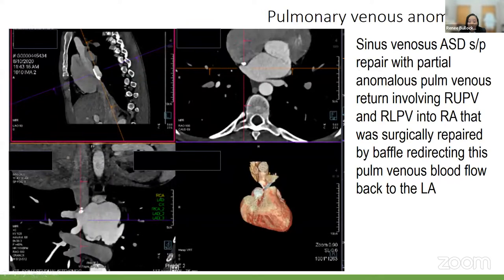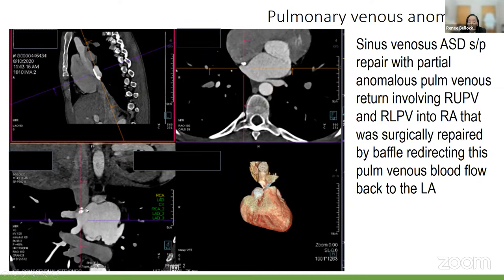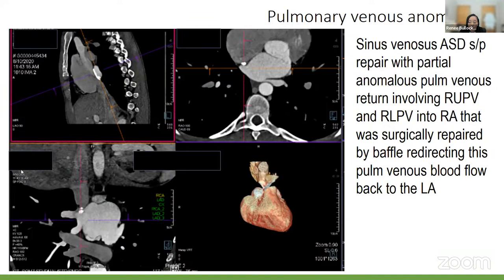This is an example of a patient who had a sinus venosus ASD repair. The repair is visible here, and the patient also had partial anomalous pulmonary venous return on the right — both the upper and lower pulmonary veins entering the right atrium. This is a post-surgical study where the right lower and right upper pulmonary veins were baffled over back to the left atrium after the ASD was closed.